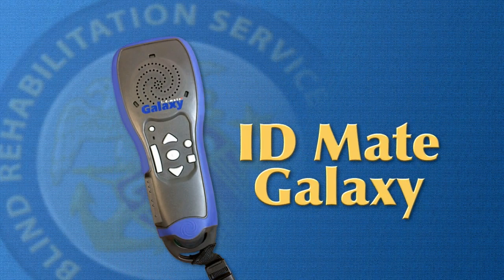In this video, we will provide instructions on how to use the ID Mate Galaxy to access nutritional information, cooking instructions, and how to record onto barcodes.